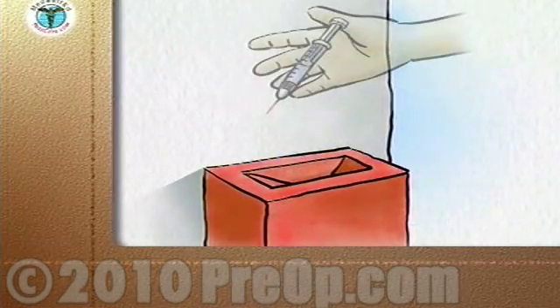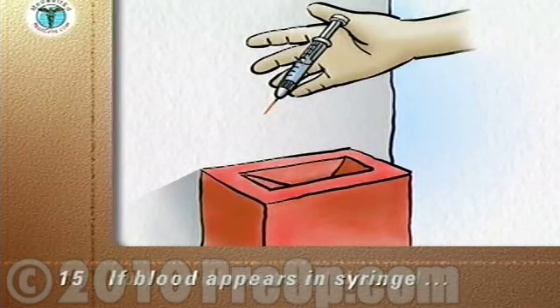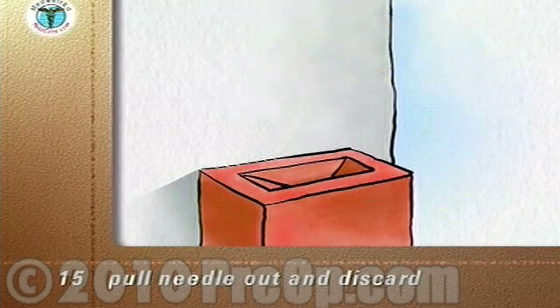If during the injection blood does appear in the syringe when you pull the plunger back, pull the needle out and discard the syringe, needle, and medication into your sharps container and start the whole process again.